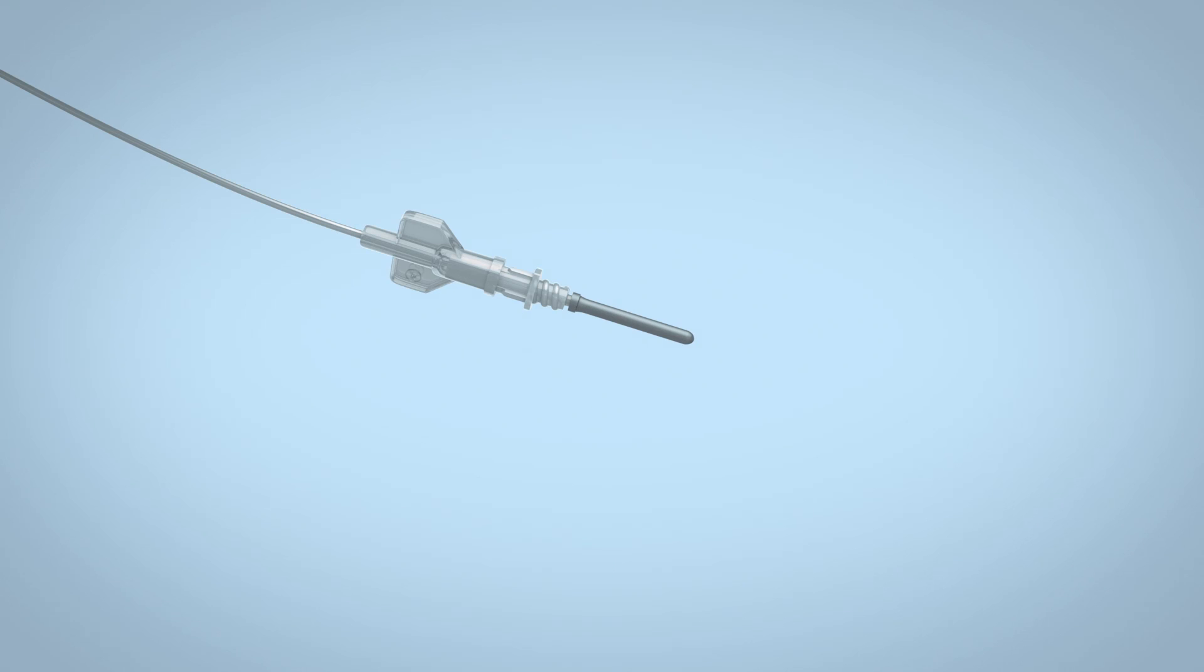For blood collection using a tube holder, thread the lure adapter into a tube holder, making sure the winged hub remains tightly connected to the adapter.